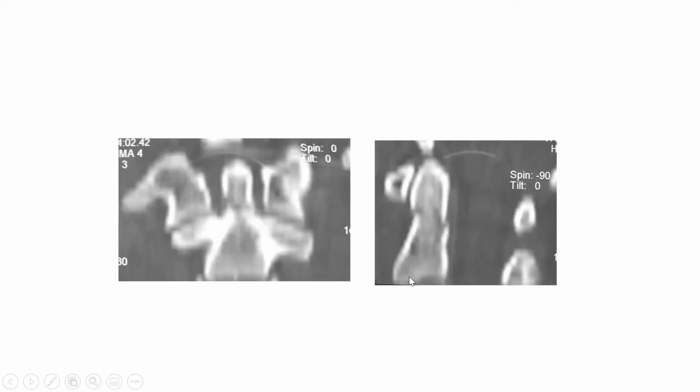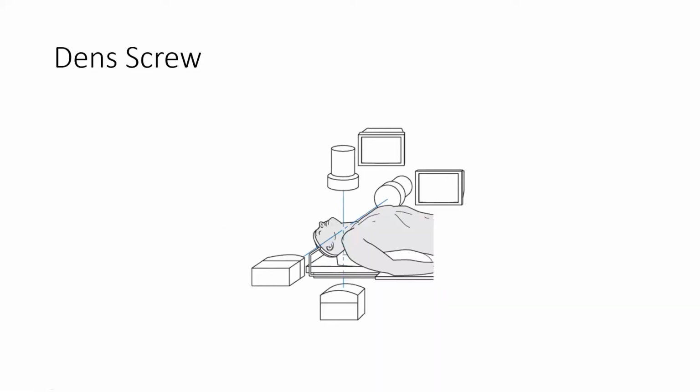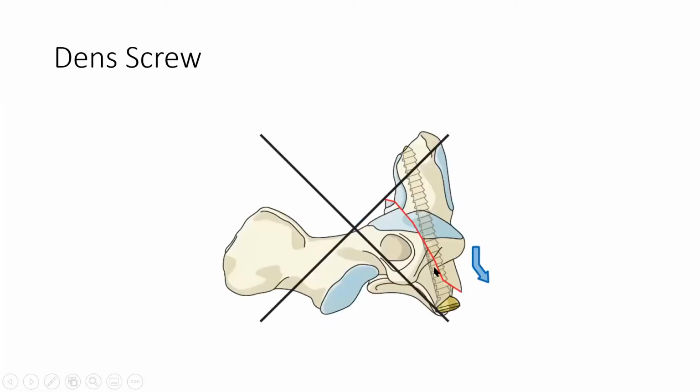Fixation of this is by putting a screw with a lag through the peg. It's quite a fiddle to approach the patient. You've got to get the trajectory, so you want to make sure that you can get the angle of the peg like that. We need biplanar fluoroscopy, so you can imagine trying to put two C-arms in theatre at 90 degrees to each other to see your angles. Obviously, the fracture principle still applies. Ideally you want the fracture at 90 degrees to the screw. If the fracture is in this plane, you can't fix it. It'll slide, so that's not amenable to fixation.